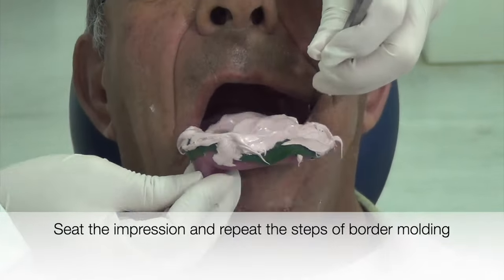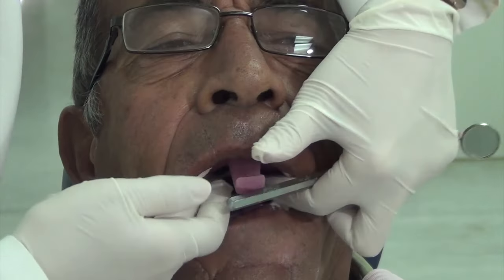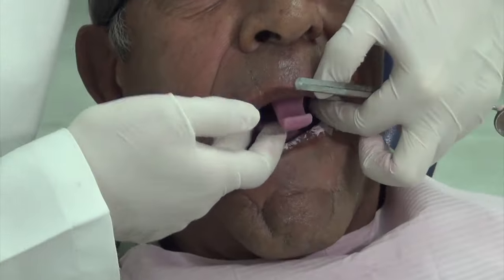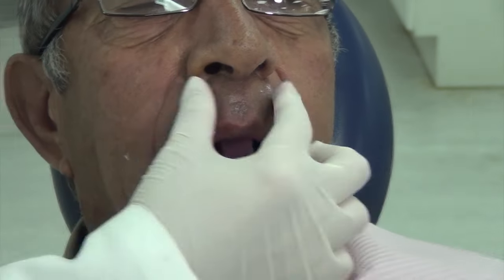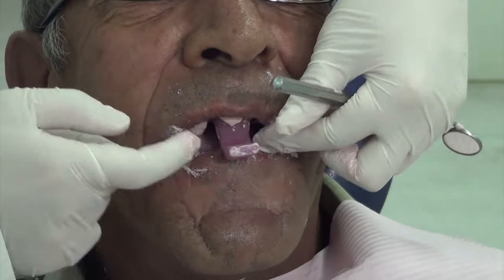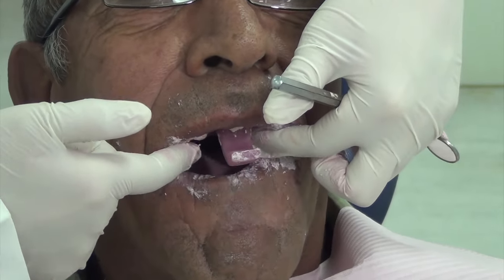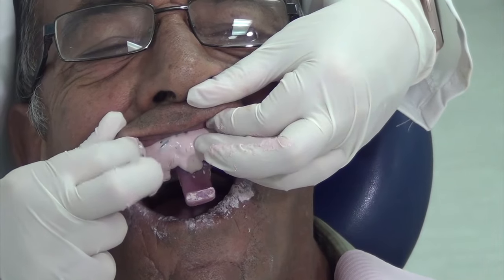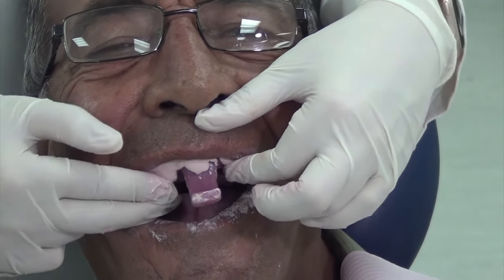Apply Vaseline on the patient's lips and cheeks to avoid adherence of the zinc oxide to the skin. Seat the tray into the patient's mouth, using the labial frenum and the tray handle as a reference. Repeat the border molding movements to record all the details of the denture borders. Prepare for impression removal by inspecting that the material has fully set.